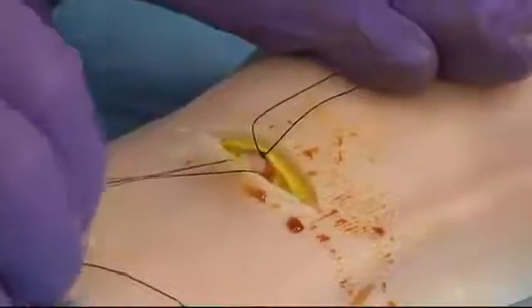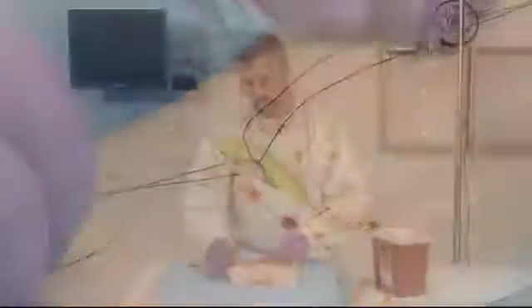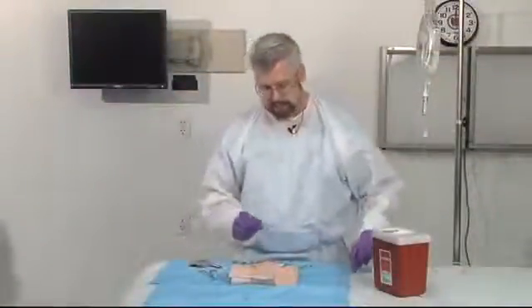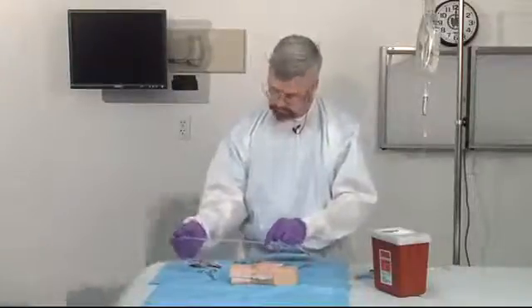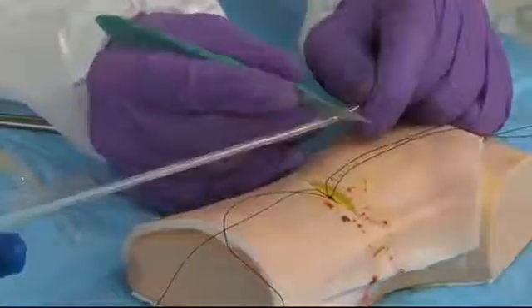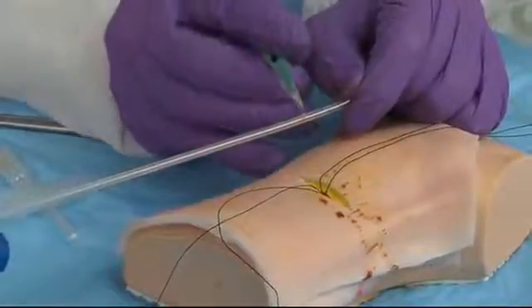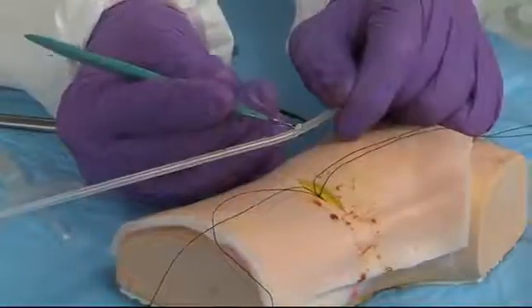The next step is you want to make sure that you cut the vessel at an angle but not completely transect the vessel, so that you can get the IV into it. One of the tricks you can do for that is: if you imagine that this piece of IV tubing is the vessel, you will place the 11 blade perpendicular to the vessel going from one side to the other, and then angling it up and out towards the foot. What this does is raises a flap that you can then effectively place your IV into.